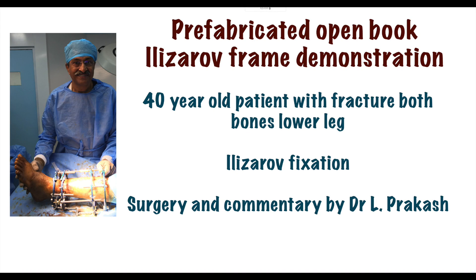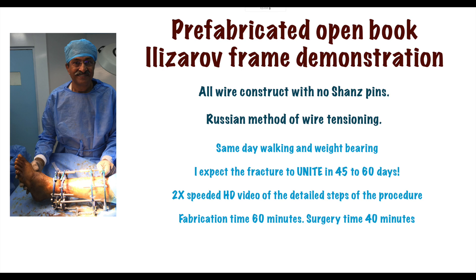This is a demonstration of a prefabricated open book type Ilizarov frame construct for closed fracture of tibia using an all-wire frame and Russian method of wire tensioning.